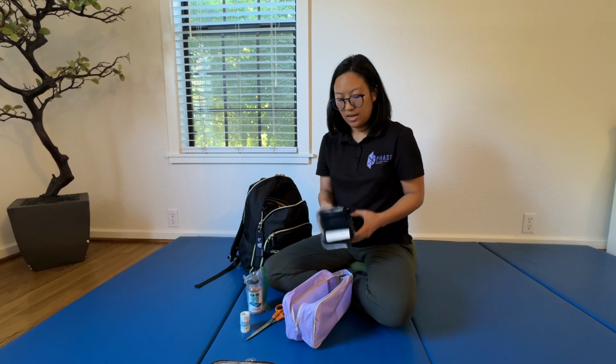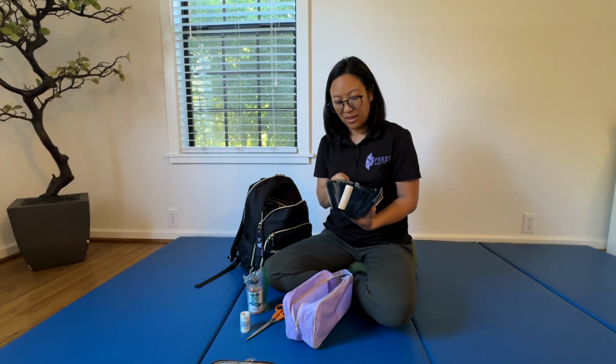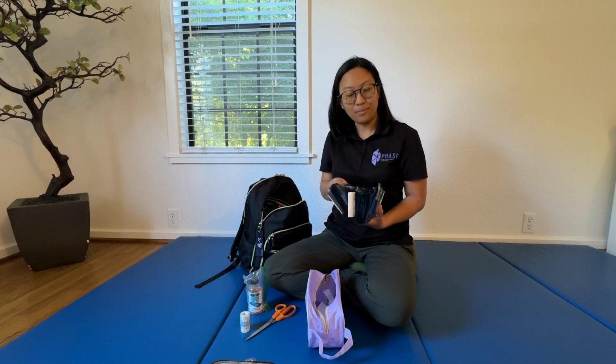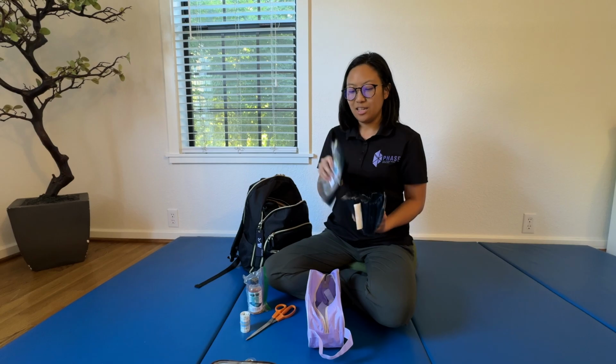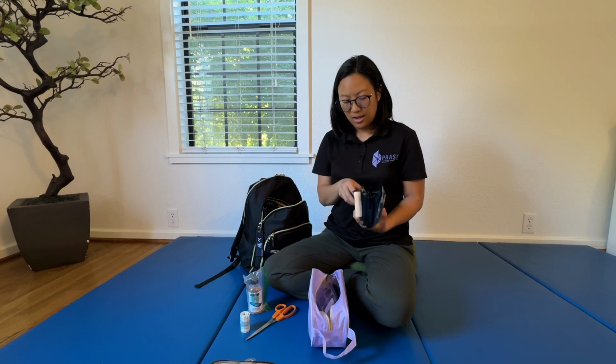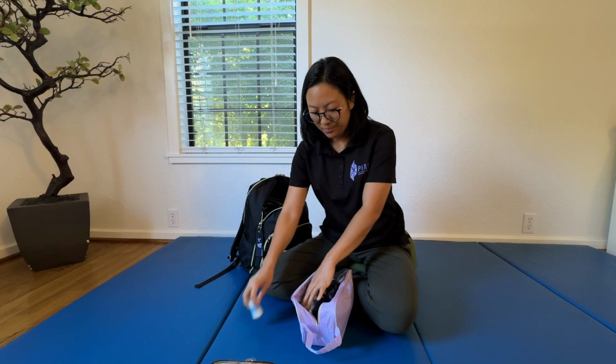So there's different ANF devices for different functions, and I explain this all the time to my clients: based on what resources we need to give to your body, that's what determines which ones we use. So I've put this together from my mentor, instructor and partner Santi the PhysioSensei. He groups them together, just ties a rubber band around them, and uses that as his way to drop them together and keep them organized based on color slash function. So this is my little grab bag for ANF, which is also very handy.